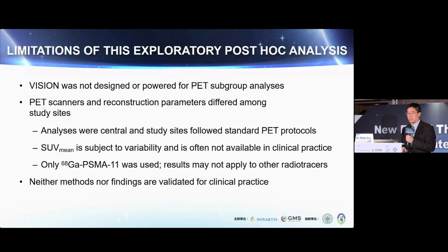So there are some limitations, of course, mainly that this artificial intelligence algorithm used for the bone is not commercially available. And only one person hand fixed every single VOI as necessary, and that was me. So I'm not at every site. But hopefully this is a good step in allowing us to really tailor our consultations and predictive power. Another limitation is that these SUV parameters are all done using gallium PSMA 11. The F18 values will not be the same.